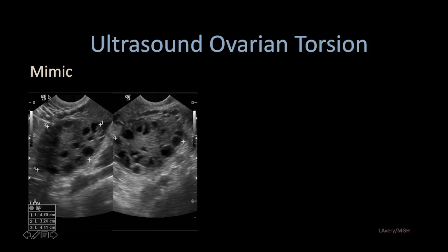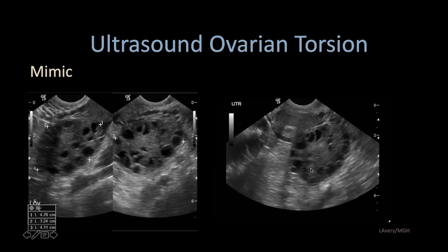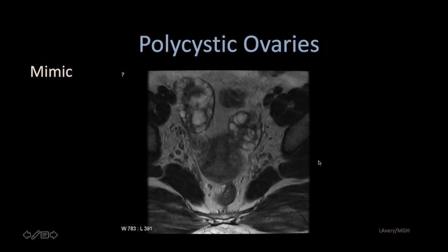Here is another enlarged ovary over 4 centimeters with multiple small follicles. The stroma is fairly homogeneous in echo texture, and the contralateral side had a similar appearance. On MRI, both ovaries are in normal position with multiple tiny follicles — this is polycystic ovarian disease and not ovarian torsion. This is a symmetric finding with no free fluid or compromise of vasculature.